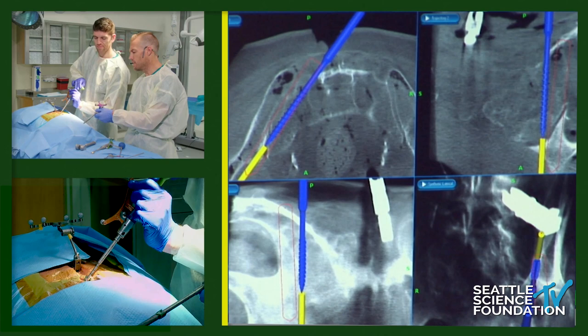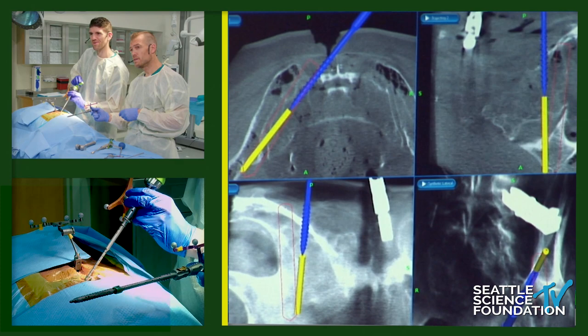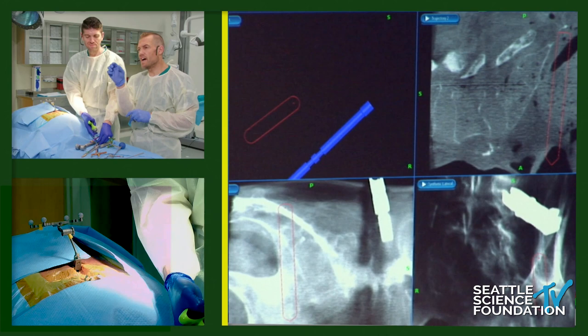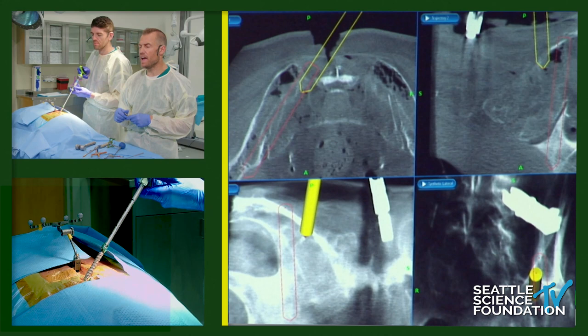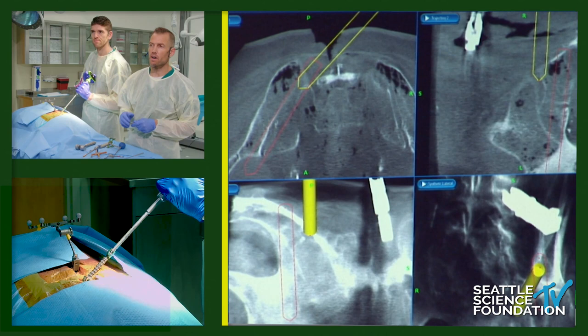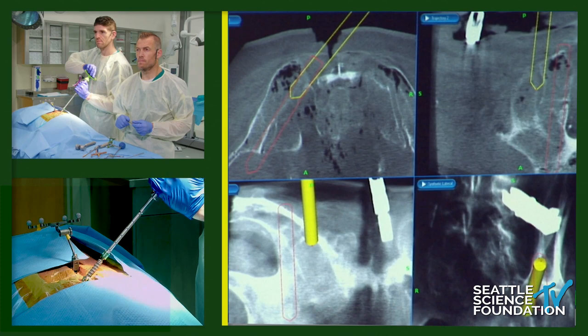Question about the navigation image — the trajectories appear to be outside the pelvis. Is that an artifact? It depends on where the final screw was dropped. You'd want to verify all of this with intraoperative fluoroscopy. That's a virtual representation of the angle of the insertion device at the time it was captured. I depend more on the feedback I'm getting from the patient, but I do pay attention to navigation. In this case I believe it's an artifact — the device is not truly that medial. I can line up the driver with it afterwards to demonstrate.